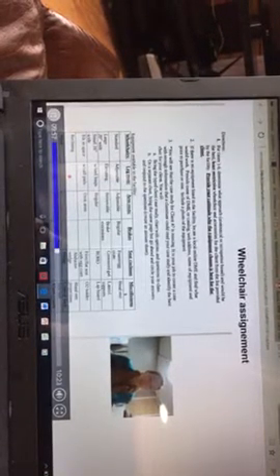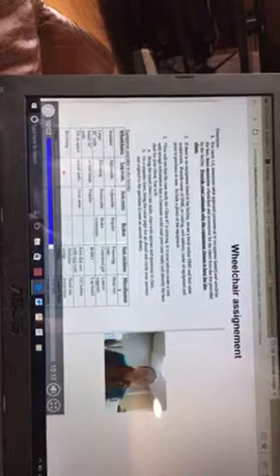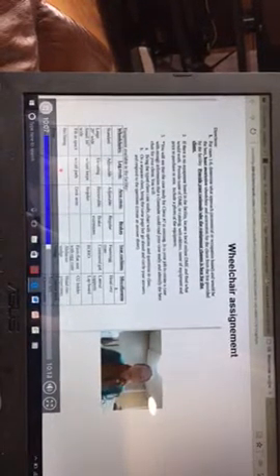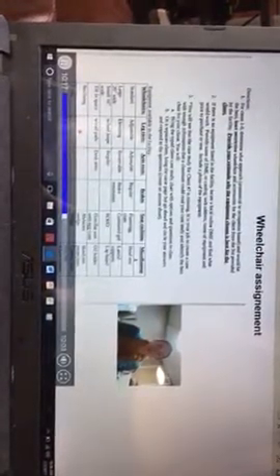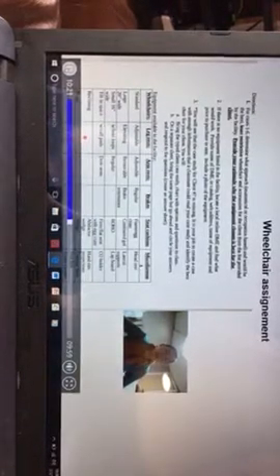The downside to the wedge and the abductor wedge is that if you have somebody who's having trouble transferring, that can make it that much more difficult for them to get up out of their chair when a therapist is trying to work with them or somebody's trying to get them out of their chair. So it prevents them from falling out of their chair, but it also might be an issue long-term, with anybody helping them get out of their chair.